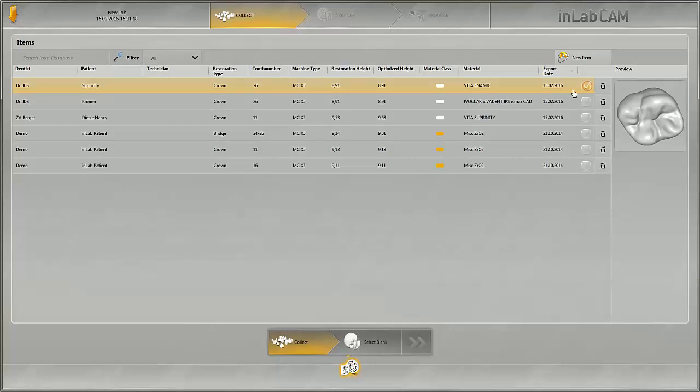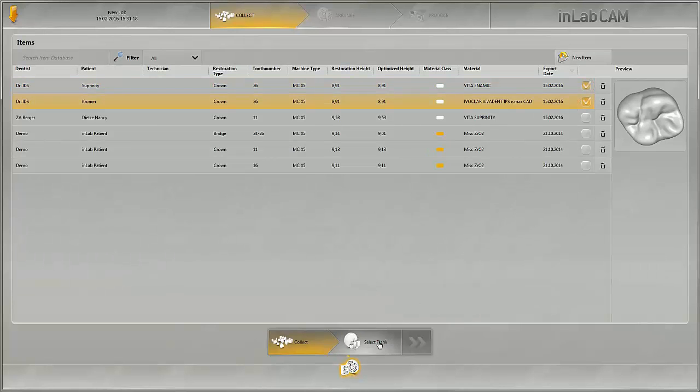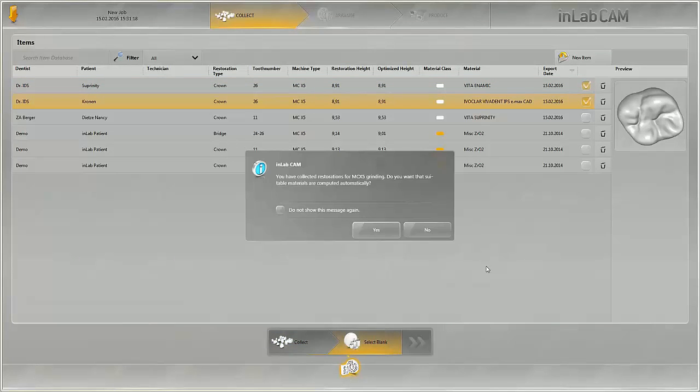In this example, two crowns are selected. If these restorations were designed in the InLab software 15, this information window pops up upon clicking on the next step.